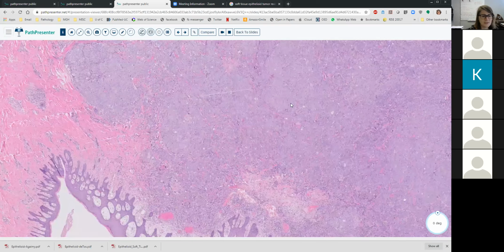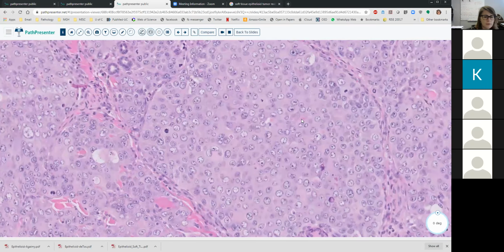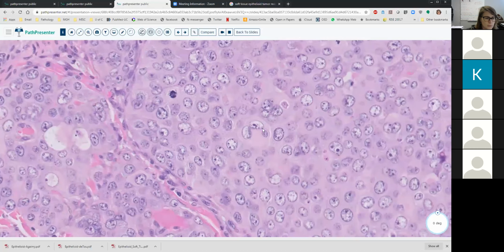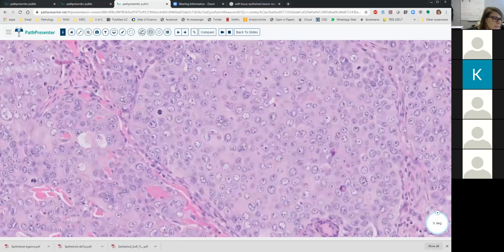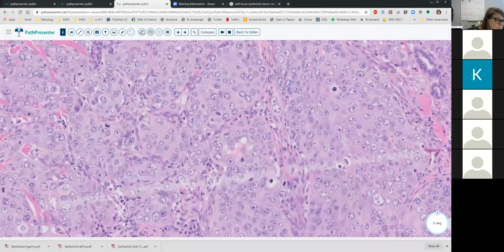Okay, I'm just showing you this now to expedite things. This is a chest wall mass of, again, very ugly, mitotically active, prominent nucleoli. Here's like a giant cell that almost is turning into a rhabdoid giant cell with peripherally located nuclei and abundant cytoplasm. Let's see if I could see a few more.